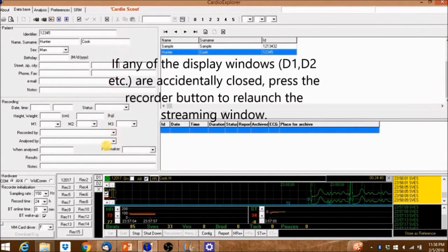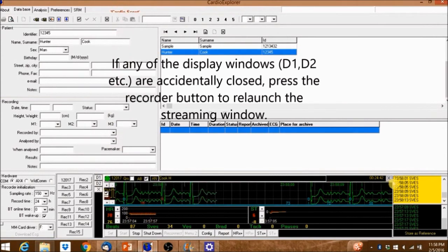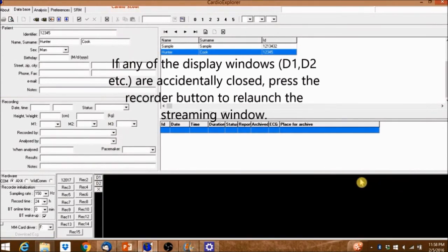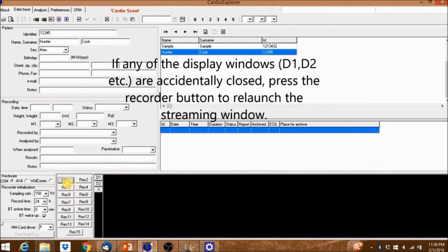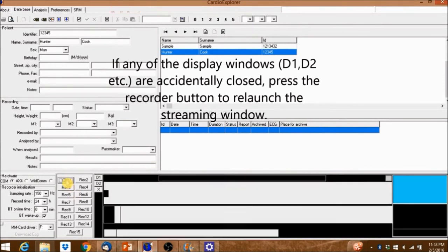If any of the display windows are accidentally closed, press the recorder button to relaunch the streaming window.